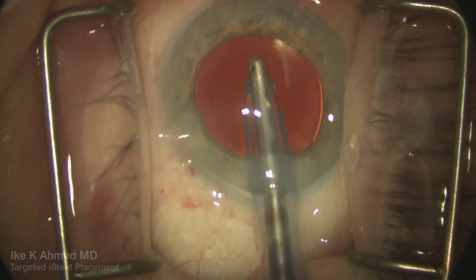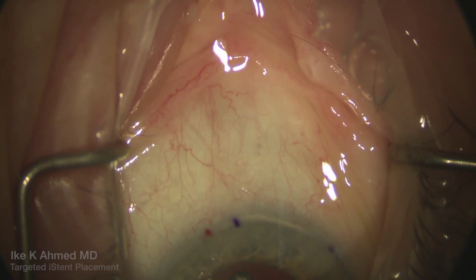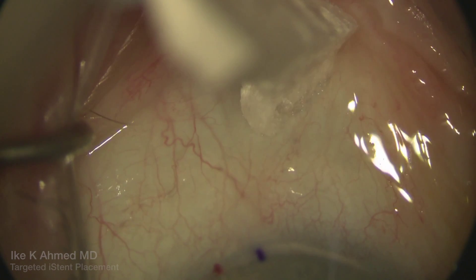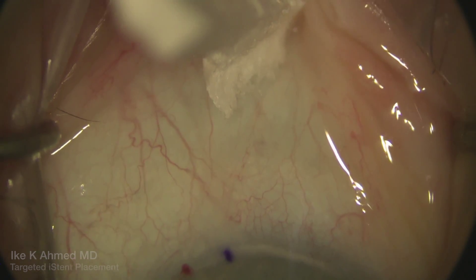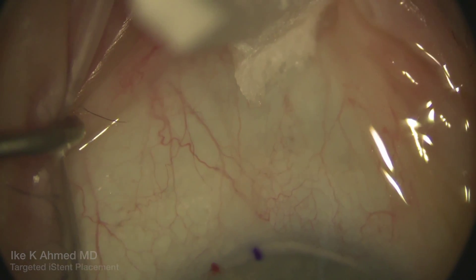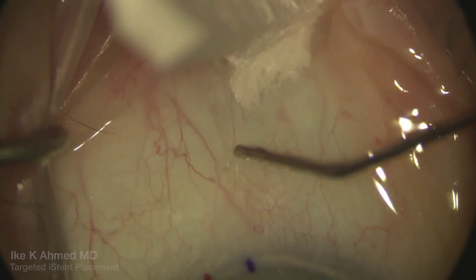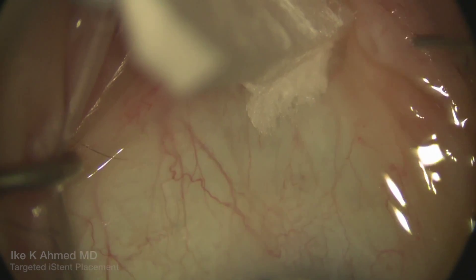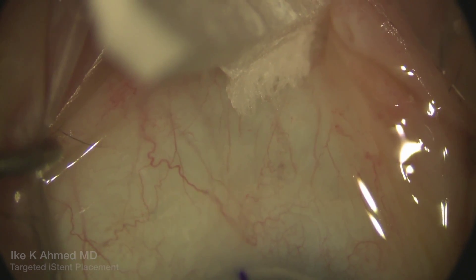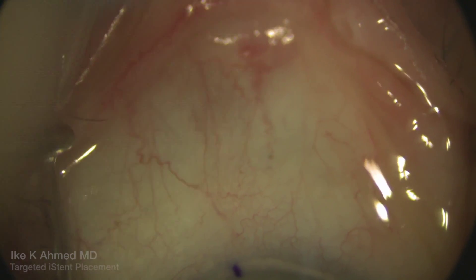After cataract surgery, the irrigation-aspiration handpiece is used to remove the viscoelastic. We're going to use irrigation to increase and decrease the pressure in the anterior chamber to show blanching of the aqueous vein present here in the infranasal quadrant. We'll watch as the blood reflux present here blanches out with the irrigation within the anterior chamber to increase the pressure and cause aqueous to pass through the eye stent into the canal and then through the aqueous vein.